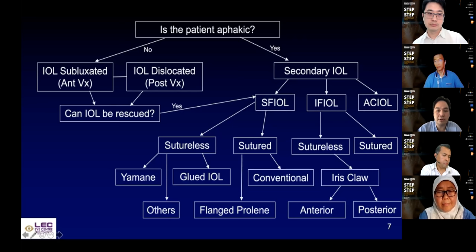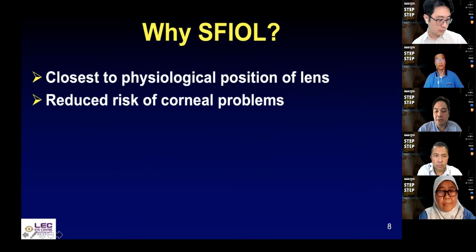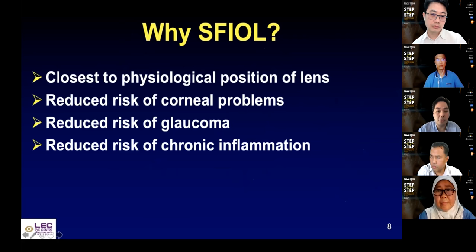If you can't, then you have to explant the lens, and then your options of a secondary lens again are open to those few things. So why? I think Dr. Noliza already mentioned, and in my mind as well, I will agree with her, this is the most physiological position of the lens, in the ciliary sulcus. It can reduce the risk of corneal problems, risk of glaucoma, risk of chronic inflammation.